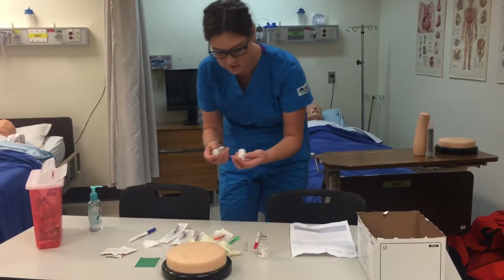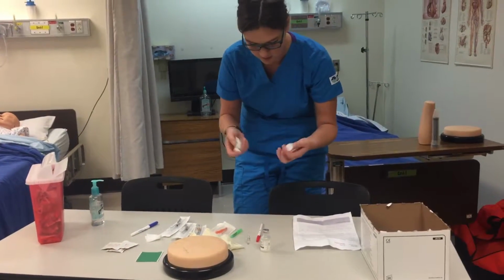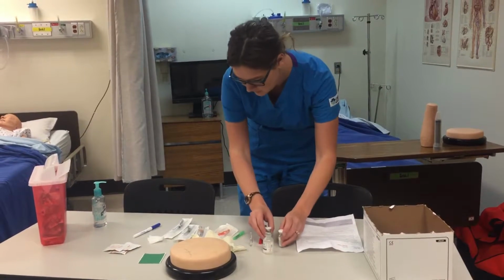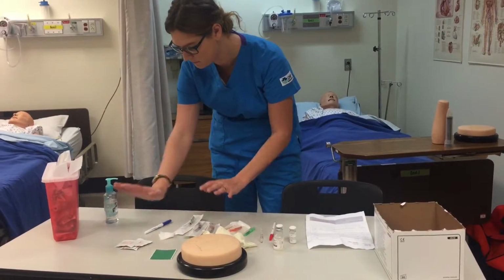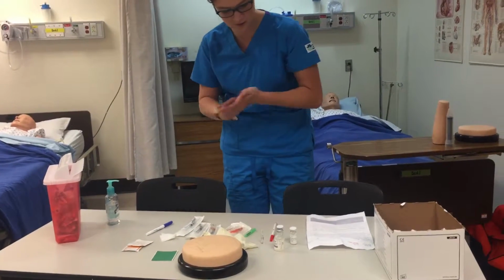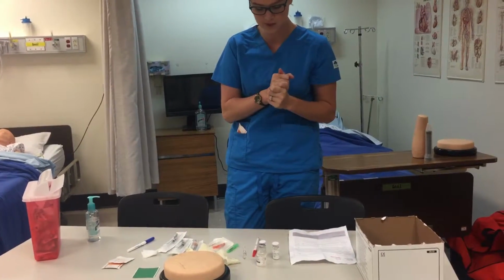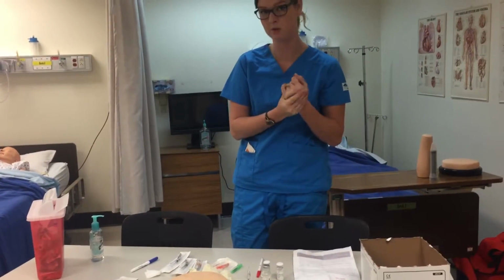And I'm going to do the 6 rights for the influenza vaccine as well. I don't have to list them because I've already listed them. There's that. I have my needles prepared, my alcohol swabs, and I would wash my hands. Okay, and now for this video, I'm going to demo opening and preparing a glass ampule right now.